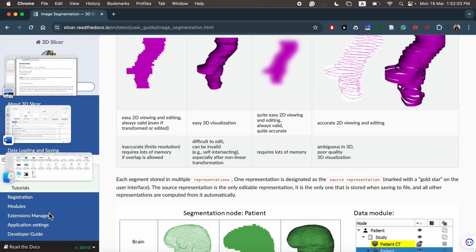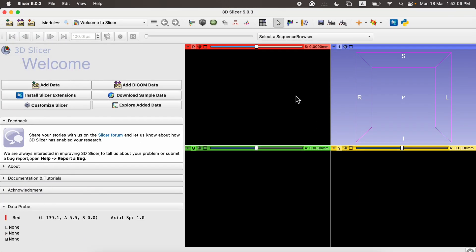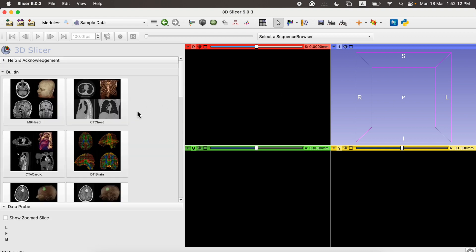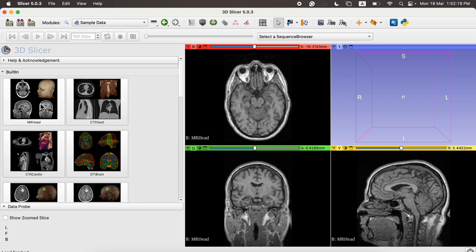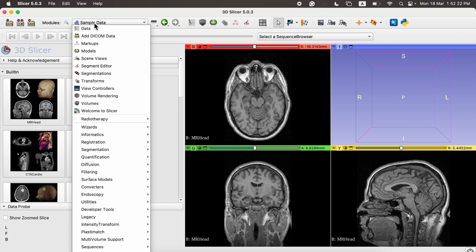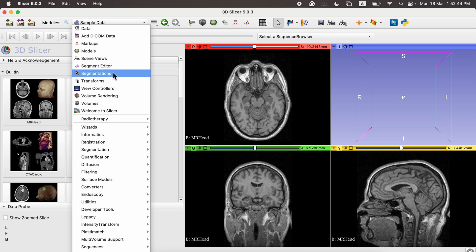Let's start. First we go to the 3D Slicer tool and we need some data to perform segmentation. We'll click on Download Sample Data and use this MR head image — simply click on it and it will display the image. To perform segmentation we require two windows: the Segment Editor and Segmentations. The Segment Editor lets us create and edit segmentations and delineate different regions.